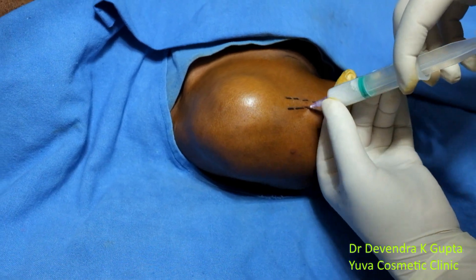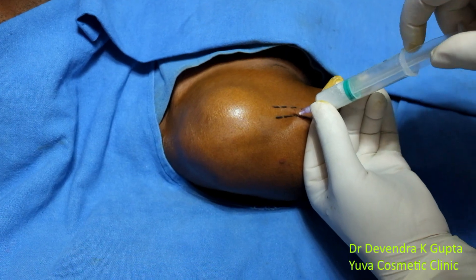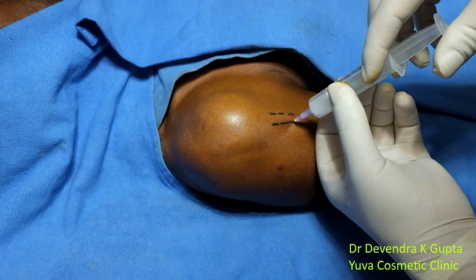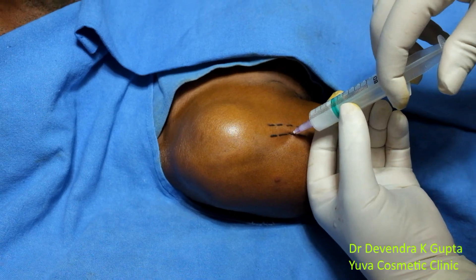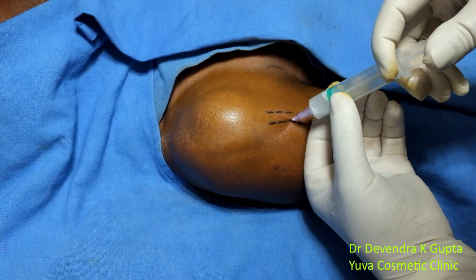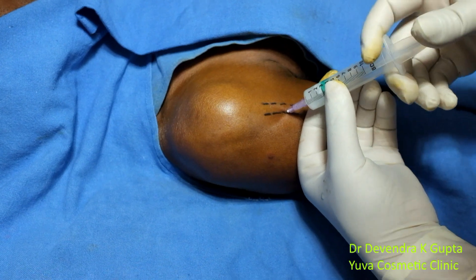Just lift the needle by 1 millimeter and aspirate before injection. Now this is little away — 1 millimeter up to the bone — and on the outer aspect of this bicep tendon, I am injecting 30 mg of depomedrol.